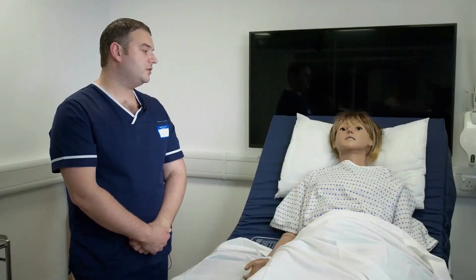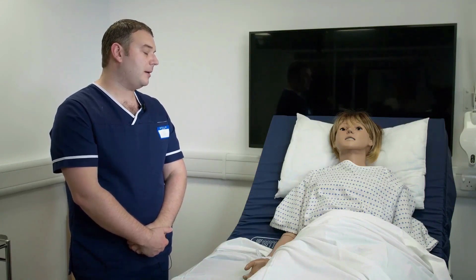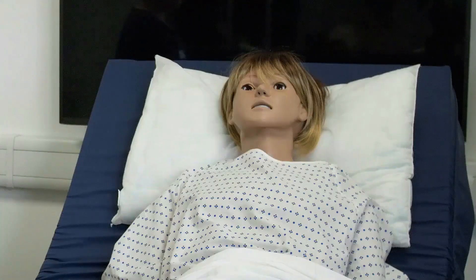I'm here today Sophie to administer some oxygen to help you breathe a little more easily. Are you happy to go ahead? Yes I am. Okay perfect.